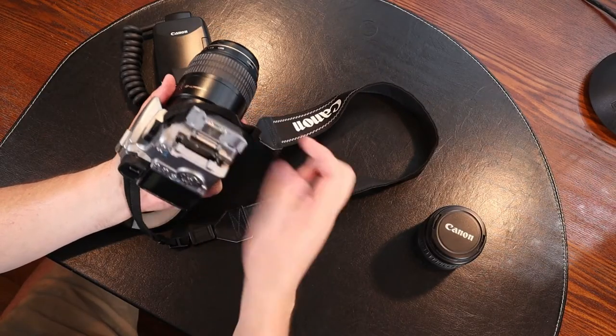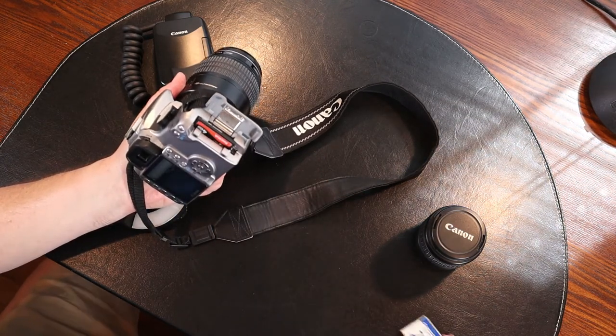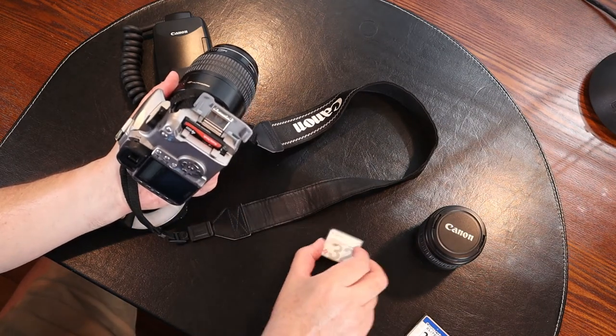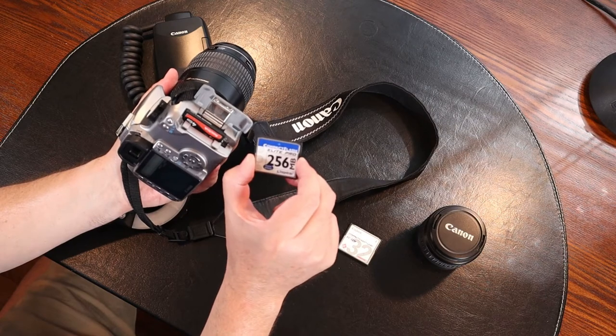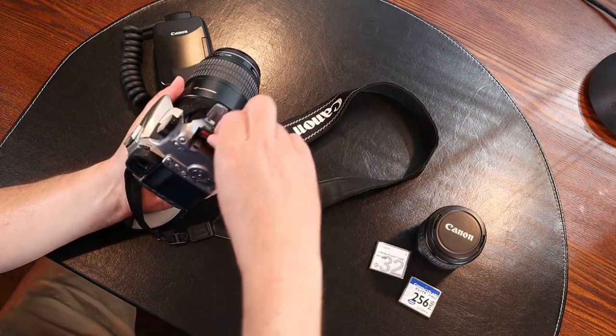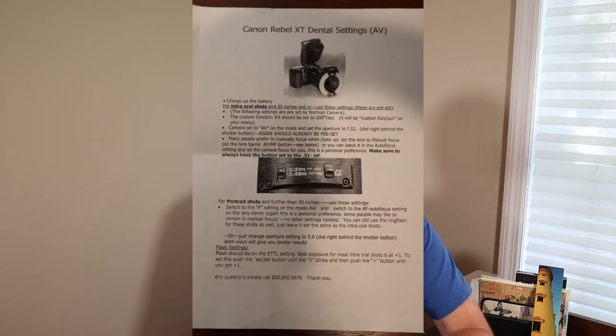This camera uses a compact flash card to save the photos. It originally came with a 32 megabyte card. Over the years I've bought bigger cards — first a 256 meg card, then a 512, and I'm currently using a 4 gigabyte card. The camera body can fit EF and EFS lenses. The camera is old enough that it doesn't record video, it only takes photographs. The camera came with a handy reference sheet from Norman Camera, which lists the recommended settings for both macro and portrait photos. I found that very helpful.